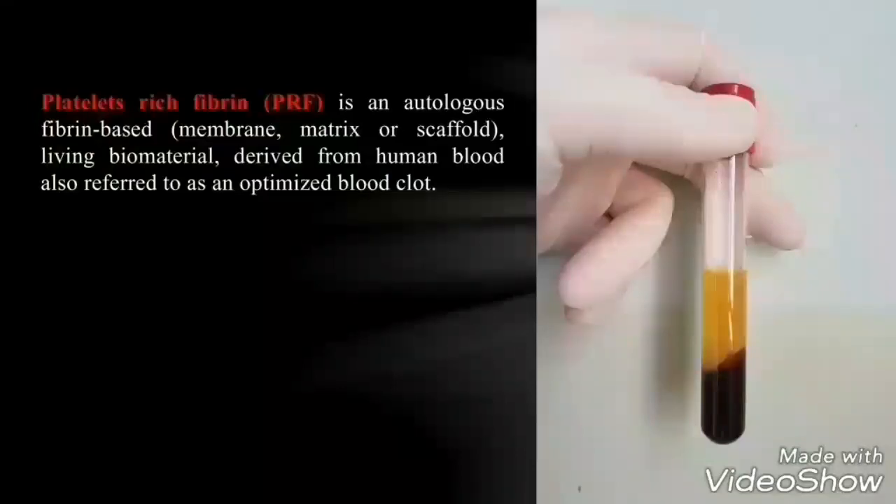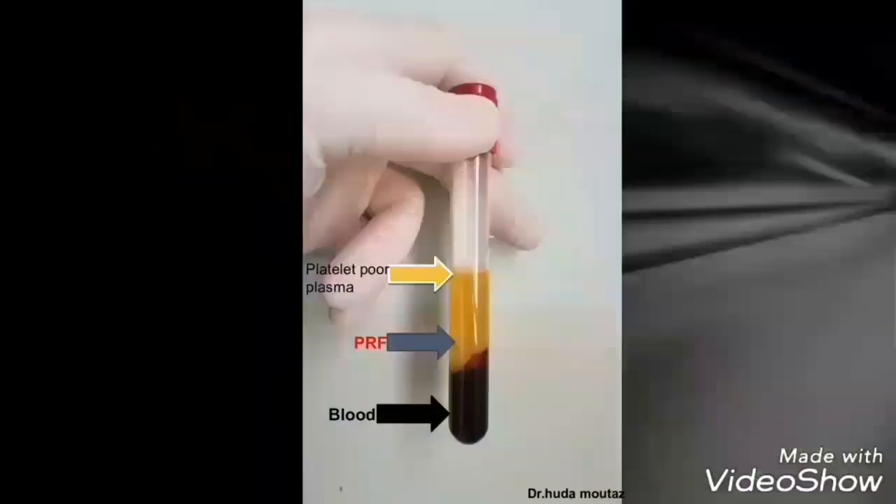Do not forget to place 10 mL of normal saline on the opposing side for balance. This blood sample after centrifuging contains the platelet-rich fibrin, which can be defined as an autologous fibrin-based living biomaterial derived from human blood — also referred to as an optimized blood clot. The sample consists of three layers: the upper layer is platelet-poor plasma, the middle zone is the platelet-rich fibrin, and the bottom layer represents the blood cells.